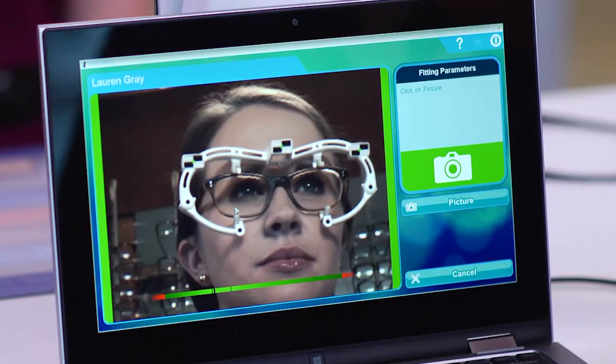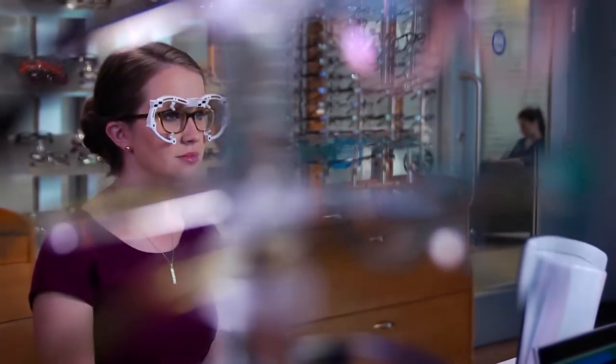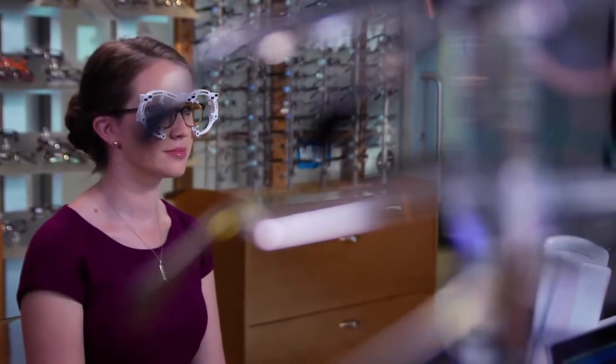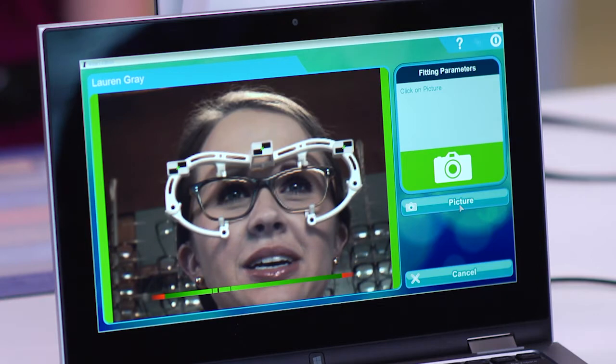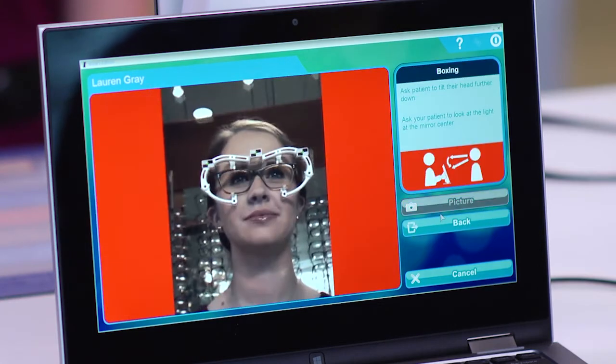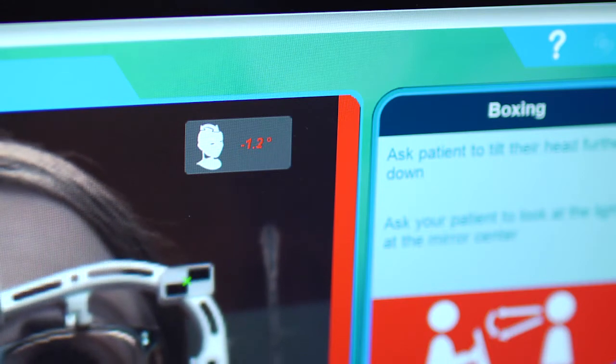In order to perform the base measurements, you need to take two pictures. Lauren, we're going to take two pictures to get all the measurements we need for your lenses. For the first picture, I'm going to ask you to look straight ahead into the distance in front of you. Ask the patient to focus on a point in the distance directly in front of her. Click on the picture or camera icon to take the first picture. Wait until the screen displays an area with degrees in the upper right corner.